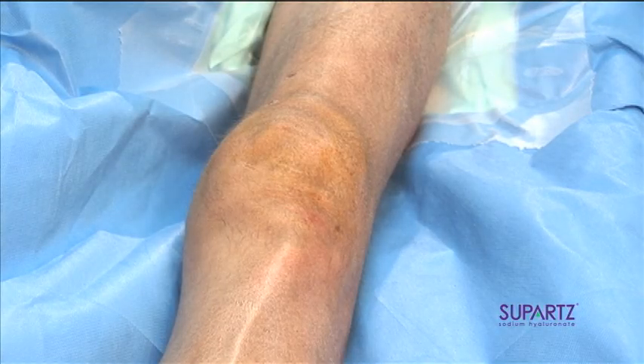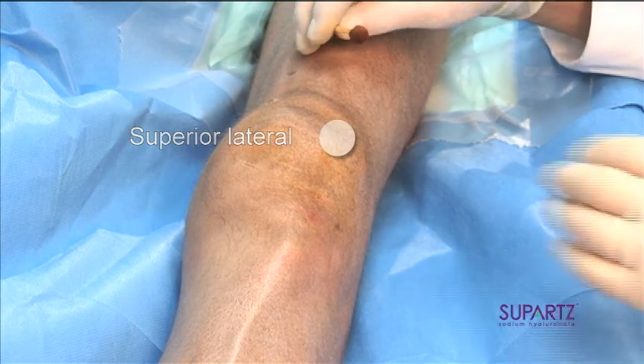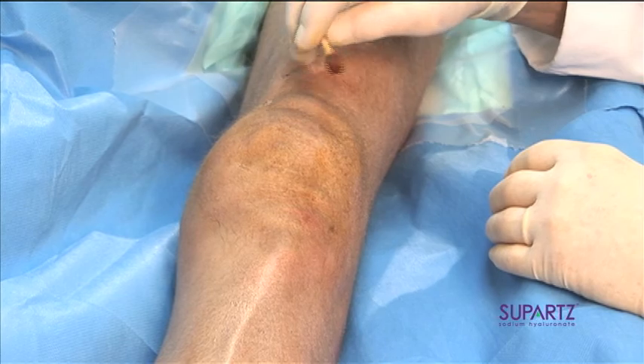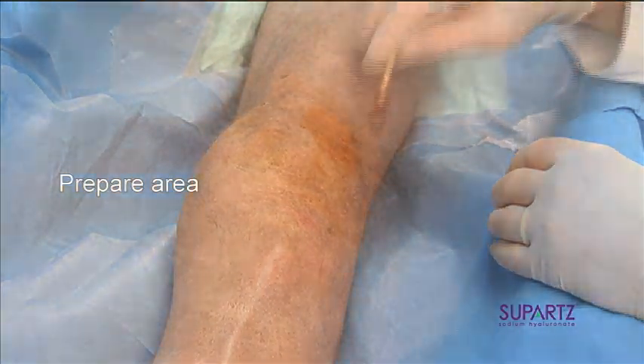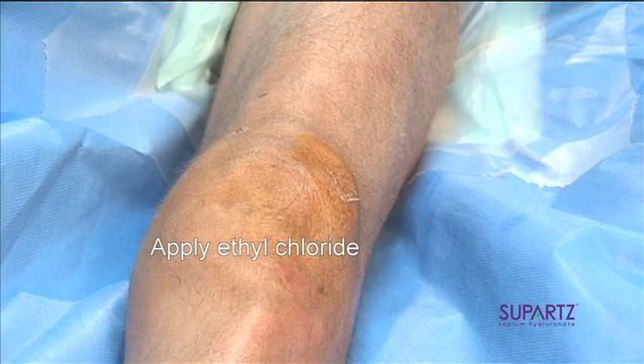We're going to demonstrate first the superior lateral portal, which happens to be the portal that I personally prefer in the extended knee position. We paint the area with povidone iodine, wipe off the excess, and spray with a topical anesthetic of ethyl chloride.